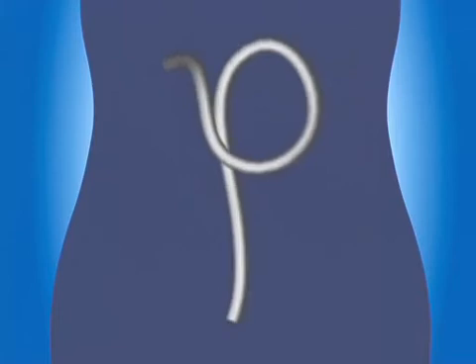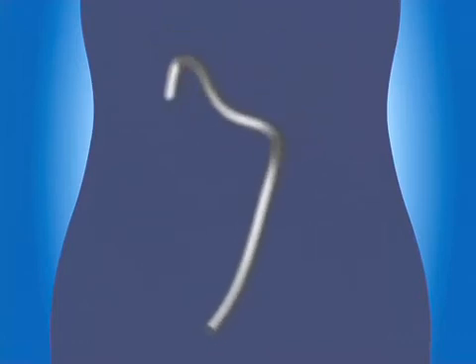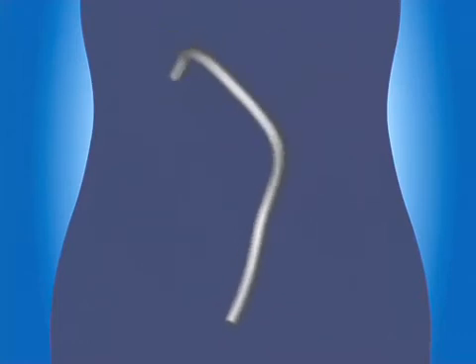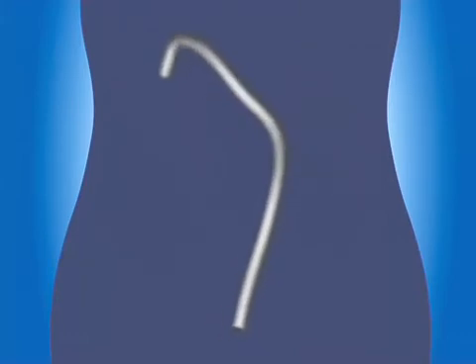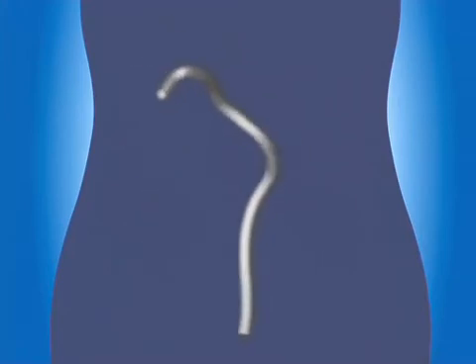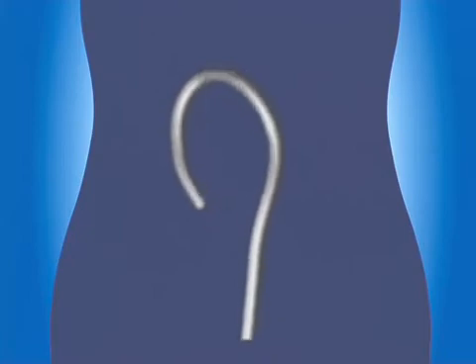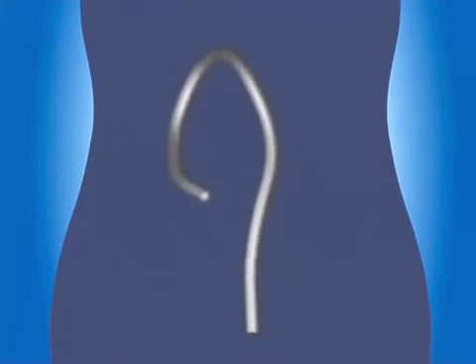This is now 45 minutes after the particular endoscopist started this procedure. Follow the gyrations of the scope and the colon until eventually the cecum is reached. And typically of such long colons, and this is the point, the bowel can be pulled back and shortened to only 60 centimetres. This colon is clearly very mobile.